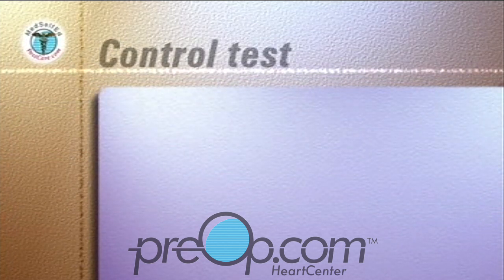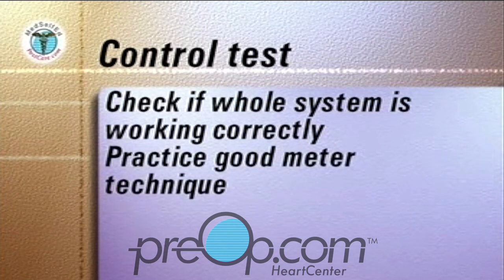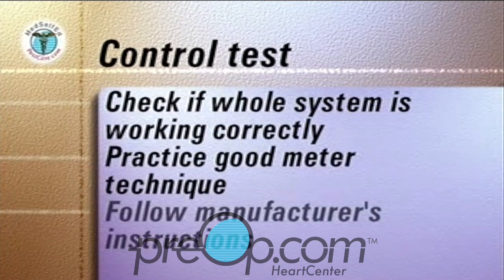In addition, a control test can be run if you need to check that the whole system of the meter and the test strip is working correctly, and to practice your good meter techniques. Follow the manufacturer's instructions, which usually involves testing a control solution of sugar that is provided with the meter.